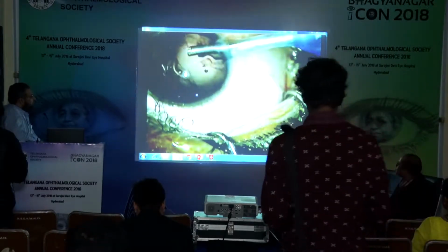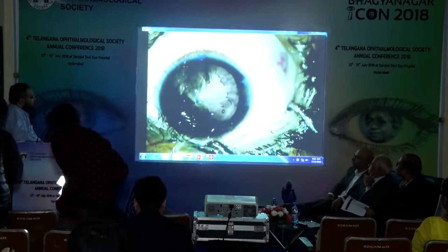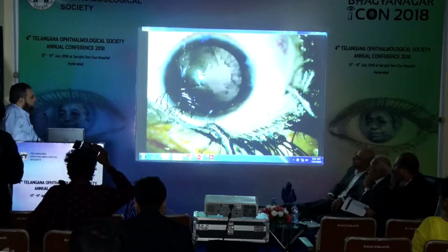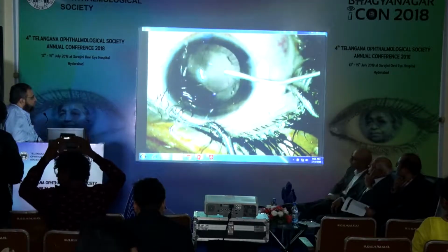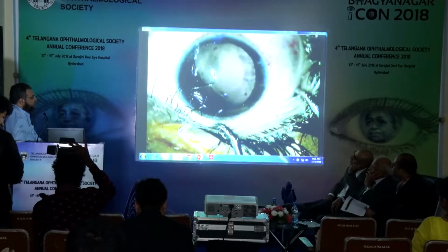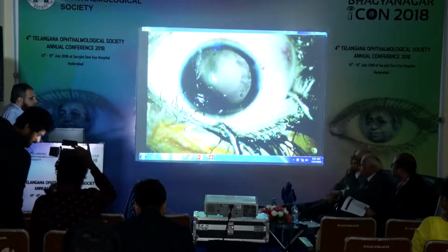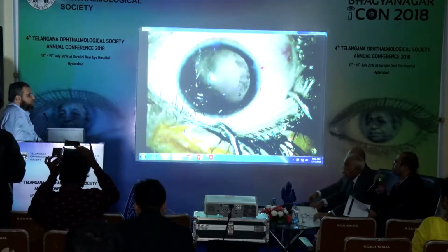Except for a few cortical fibers, the whole lens, the whole cataract, has been cleared. And the rest of the video is a routine lens implantation. So, I think we can stop the video here.